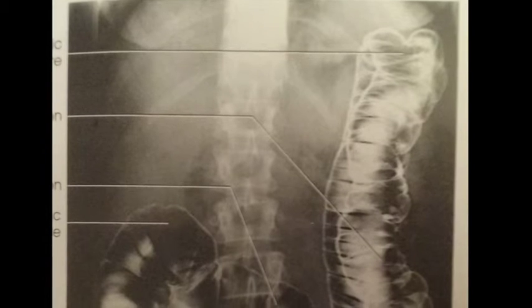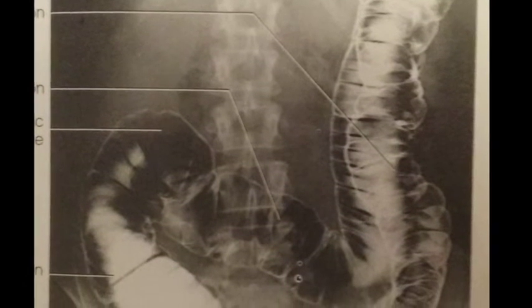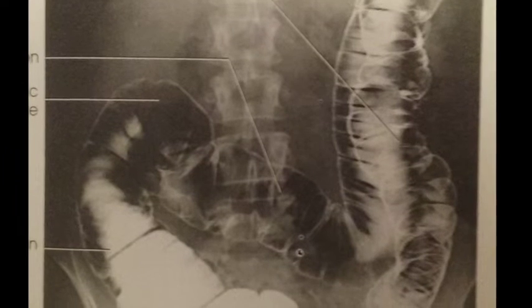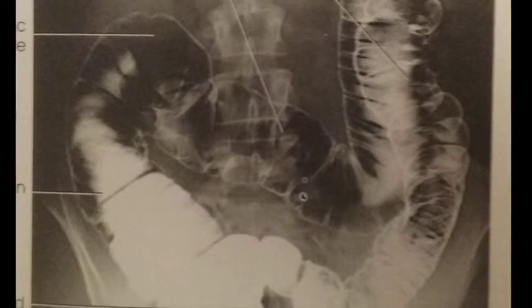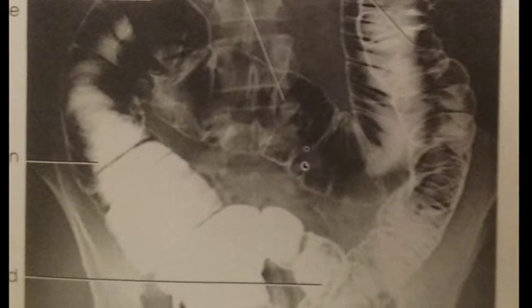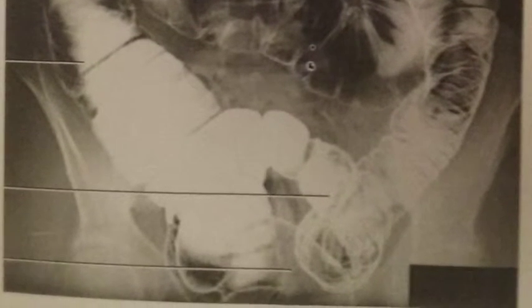The projections from here on are showing the images with the contrast in the colon. The first is a PA projection, and you should have proper collimation. The entire colon, including the flexures and the rectum, should be shown. 2 IRs might be necessary if it's a hypersthenic patient. The vertebral column is centered so that the ascending and descending portions of the colon are included, and of course proper technique that shows the anatomy.